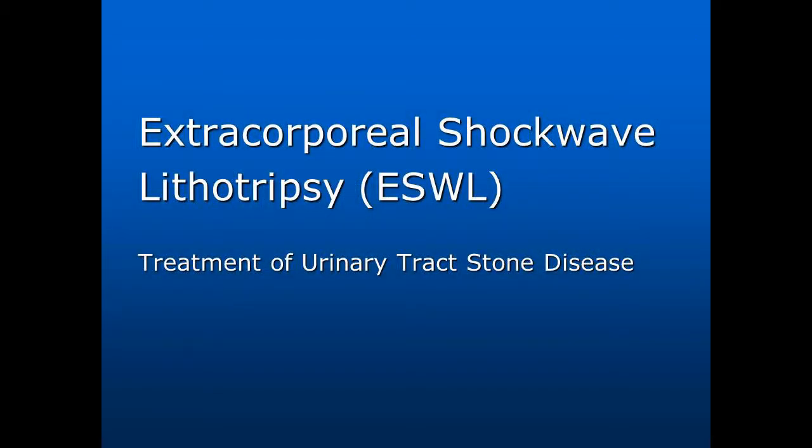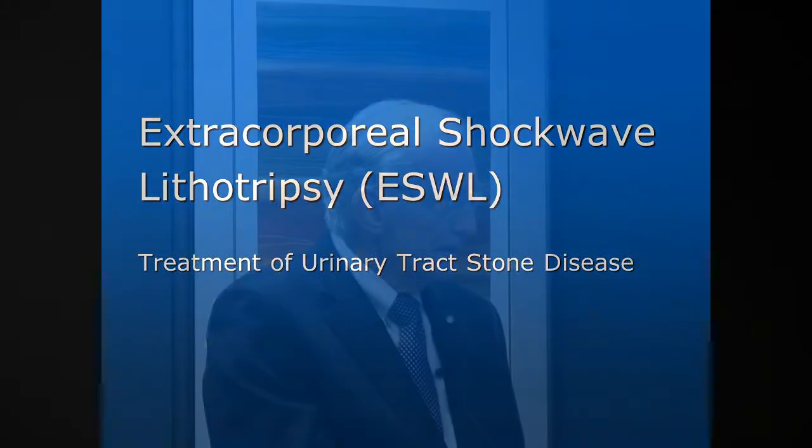There's a technology where we don't have to invade the body at all, and that's called extracorporeal, meaning out of body. Extracorporeal shockwave lithotripsy means that if you can focus the stone in a focal point, then you can deliver energy to the stone and not do anything to the tissues in between. A shockwave travels through water. We're made of water, and the rest of it is just a masquerade.